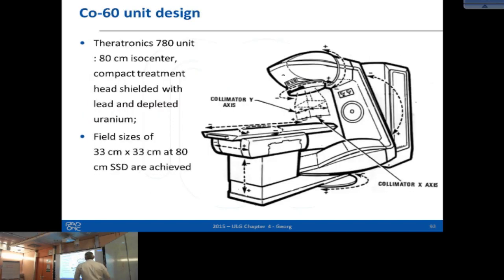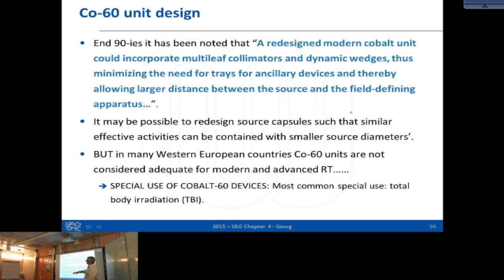They really took the whole C-arm, cut it off here, and installed it at the top of the treatment room, in some corner, and then they also had a standard accelerator in the whole bunker. By just using the different geometry, they could perform total body irradiation with the cobalt unit, and the patient was lying there. But you can do similar principles with the patient moving.